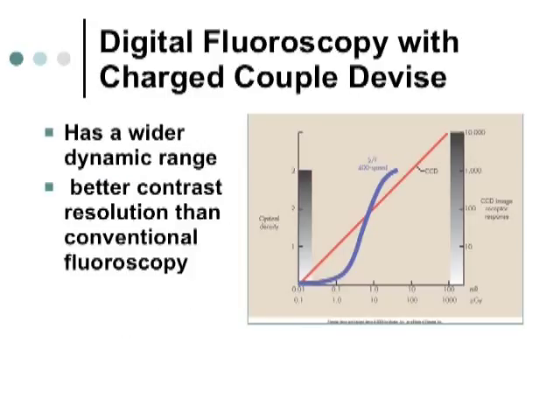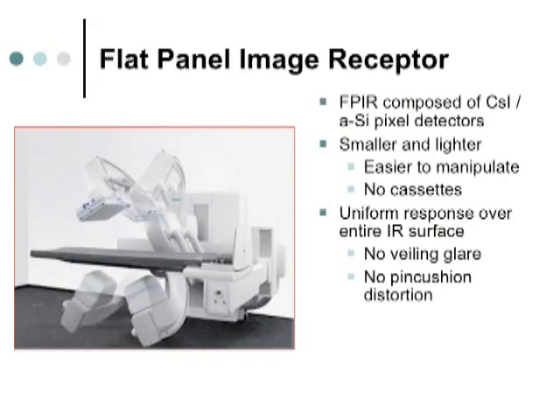Okay, so digital fluoroscopy, if you were to put it in your department, you would have a wider range of contrast. You're going to have a lower dose, better resolution, because of this grayscale that we can pull out in post-processing. It's great for subtraction. For those people that do angiography and things, the subtraction capabilities of digital are much, much higher than the old conventional methods.